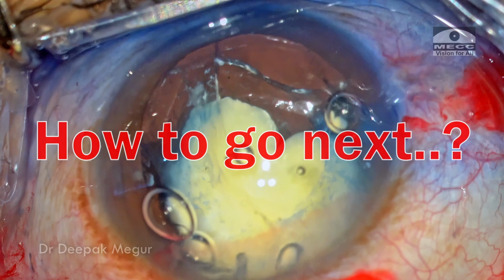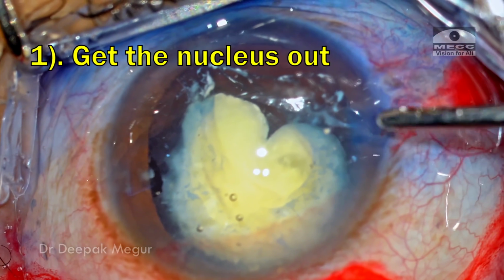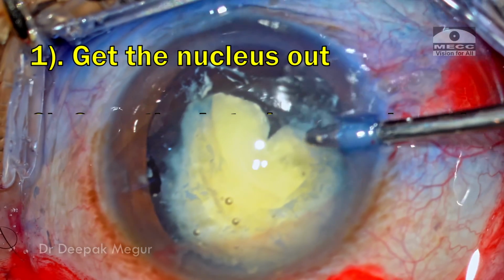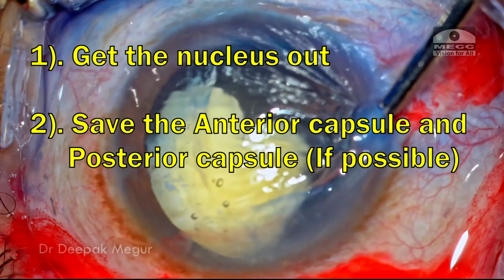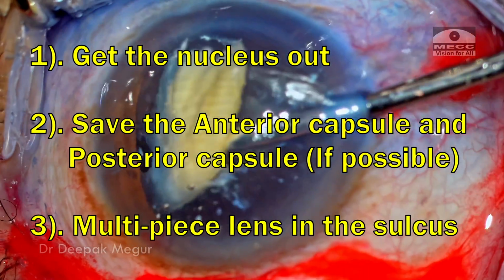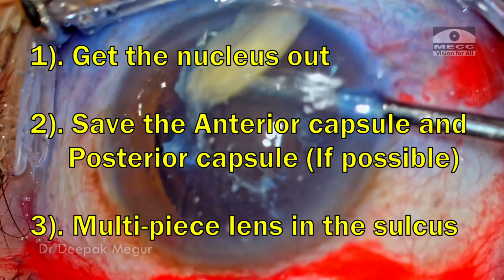Now how do you go about it? At this stage I'm thinking, the first thing is I just want to get the nucleus out and then, if possible, try to save the anterior capsule and the posterior capsule and then consider implanting a multi-piece lens in the sulcus. So that option I've still kept ready.